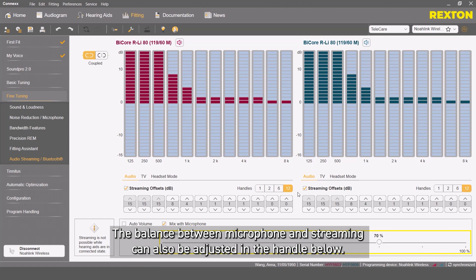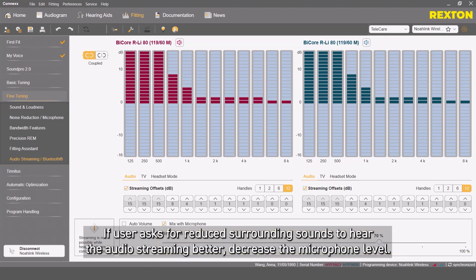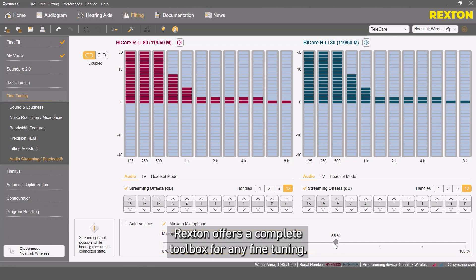The balance between microphone and streaming can also be adjusted in the handle below. If the user asks for reduced surrounding sounds to hear the audio streaming better, decrease the microphone level. Rexton offers a complete toolbox for any fine-tuning.